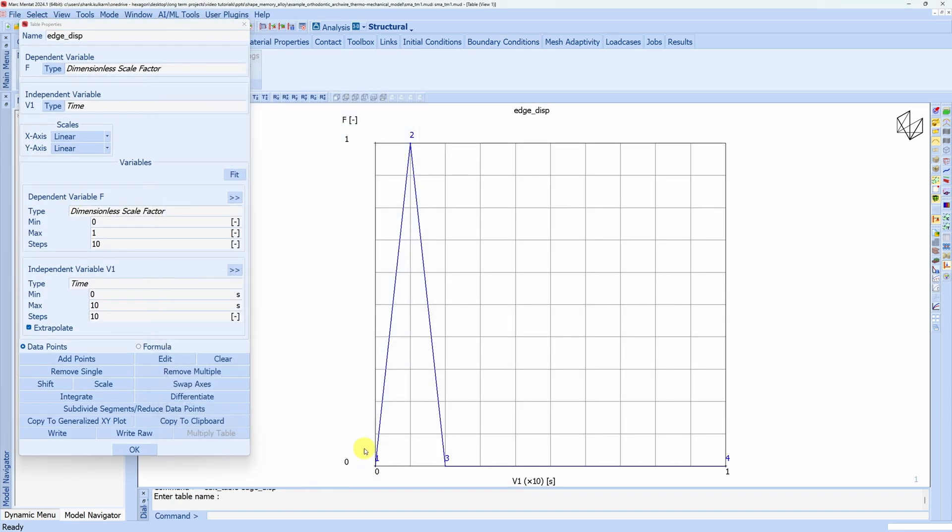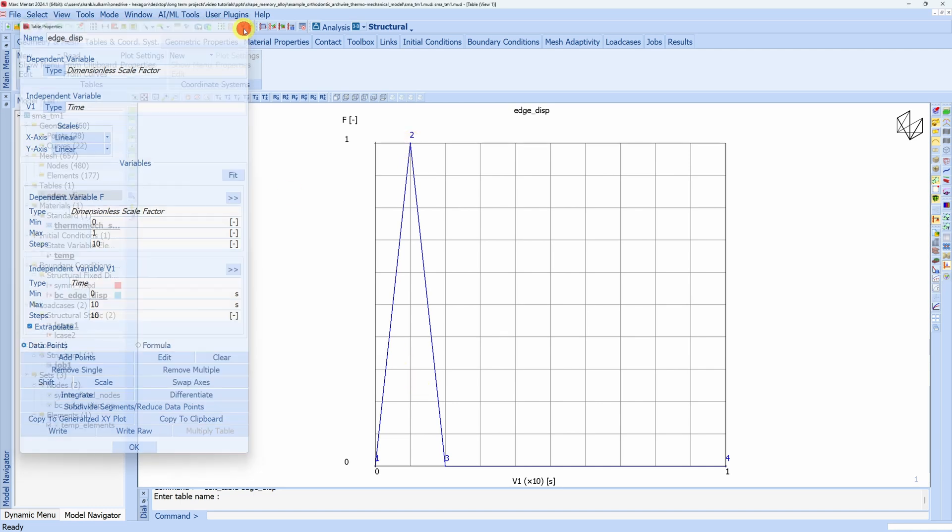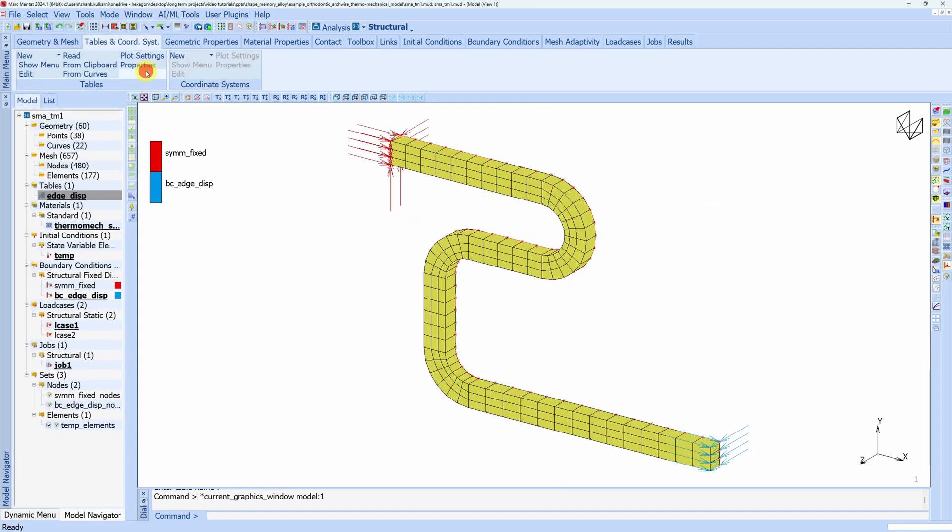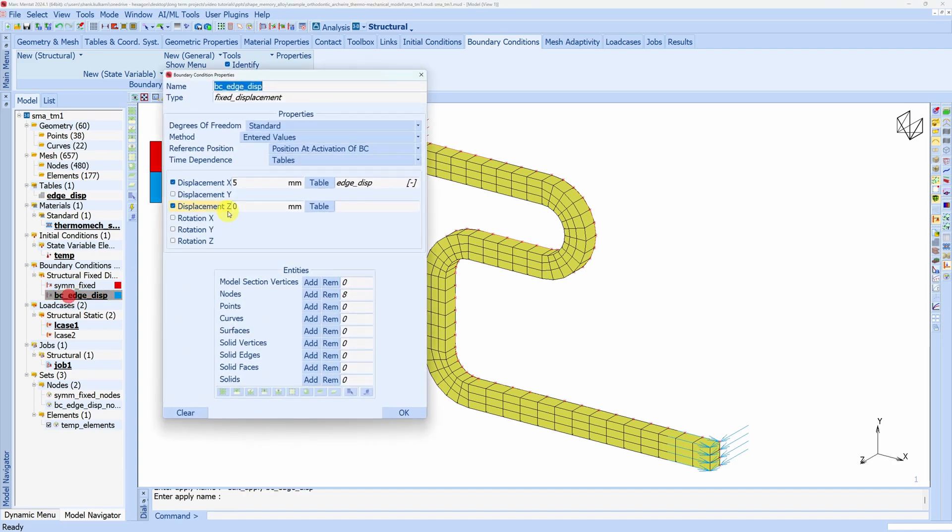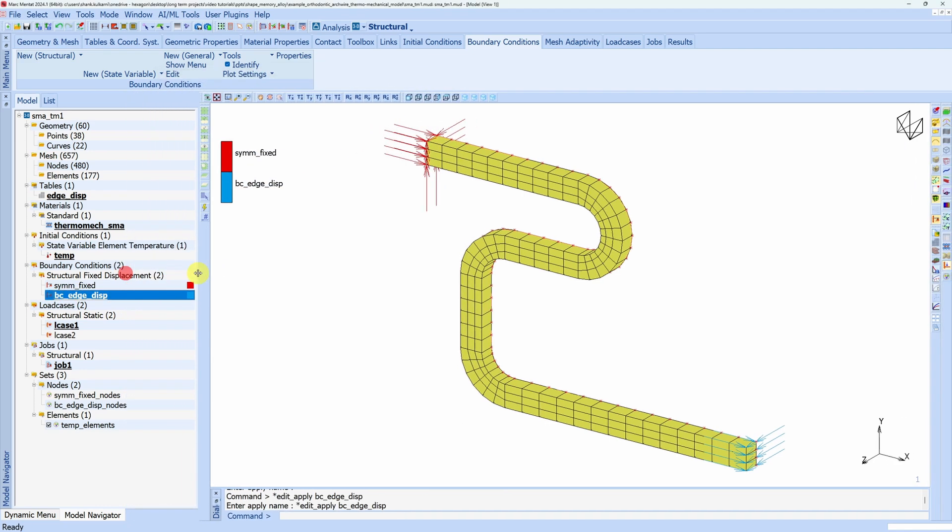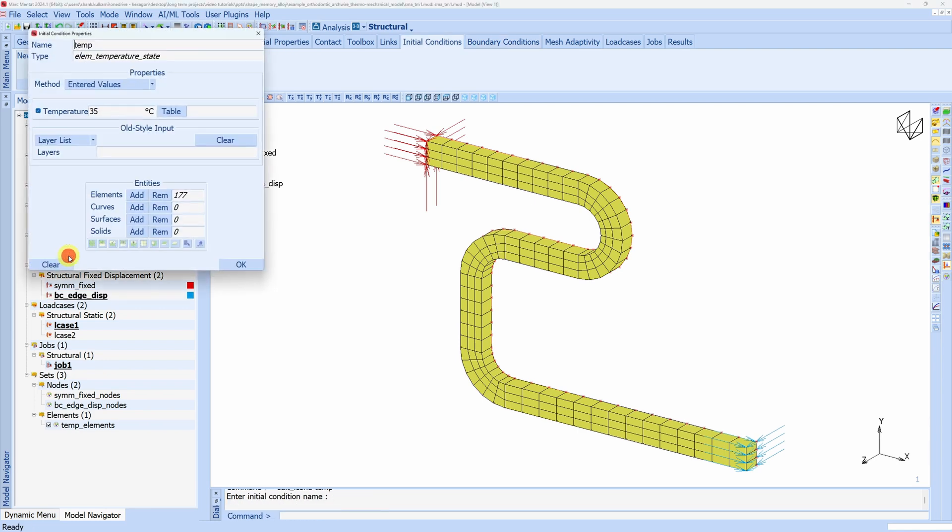This is the table where we are increasing the displacement and again decreasing it. Go back to model. We are also restricting that wire to move in the z direction. That's why this displacement is zero. Then the temperature is defined over here in state variable element temperature. You can see right now it is 35 degrees.